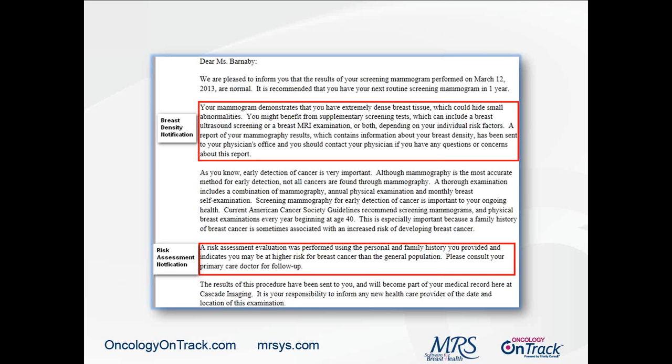But what if our patient has a high-risk score? Maybe she's negative with a high-risk score. Or what if she lives in one of the states that has the breast density notification laws? If you will notice in the example, there's a couple of red boxes. MRS can populate either the breast density notification statements, or they can populate a paragraph about the patient's risk assessment. Depends on what the site prefers for the wording of these paragraphs or what the state law is.